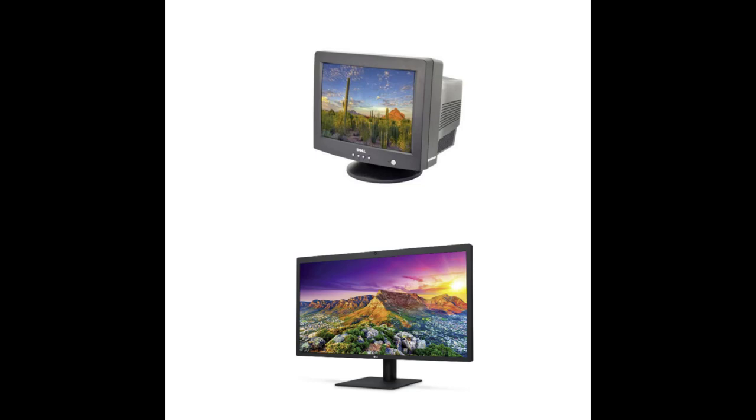So we don't need to cover what a cathode ray tube is, but if you are curious, it is basically those really old TVs with the big monitors. They were heavy, kind of had that bulgy glass looking front to it. So much older versions of what we have currently. Now, most of our modern systems are going to use some sort of flat screen computer monitor, which is going to allow for more lines on the display, faster refresh rates, and really blacker blacks. So it's going to use LCD or OLED technologies to display the images that we are creating from the system.